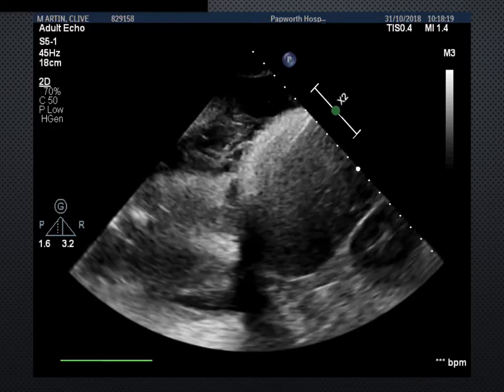There'd be very little success in probably trying to drain this effusion that we're seeing, although it doesn't look to be significant in terms of size. It's probably tracking up higher up the lateral aspect of the chest wall, because we can see that the adhesions are forming and attaching to the diaphragm there.